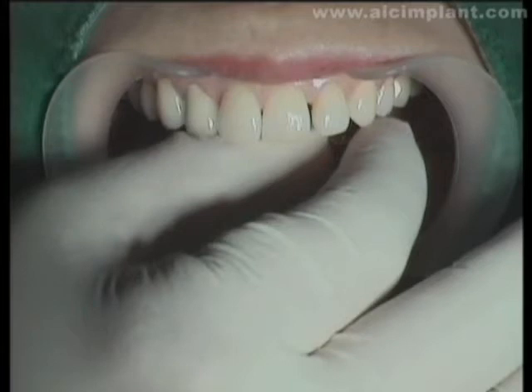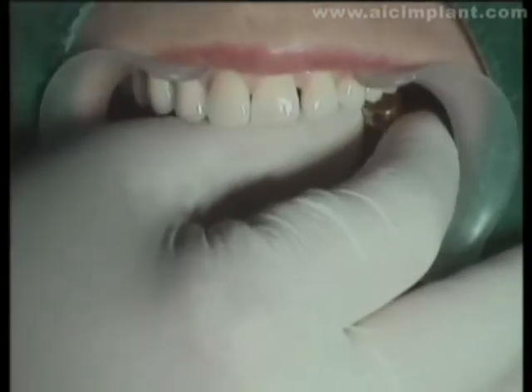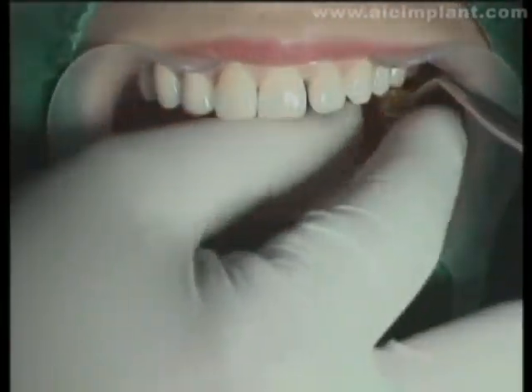First, since the implant is of bone level, the collar height must be determined according to the implant depth. Second, the collar diameter must be decided based on the tooth position. Finally, the height must be decided according to the vertical space. In this case, it is a first molar. Thus, the collar height was set to 2 millimeters, considering the installation depth, with a collar diameter of 6.0 millimeters and a height of 4.0 millimeters. A 1.2 hex driver is used to connect a rigid abutment.